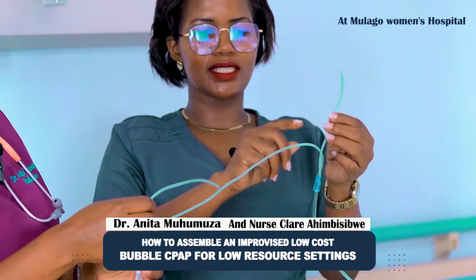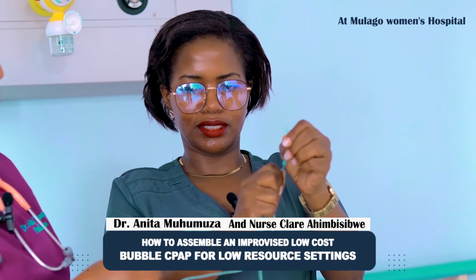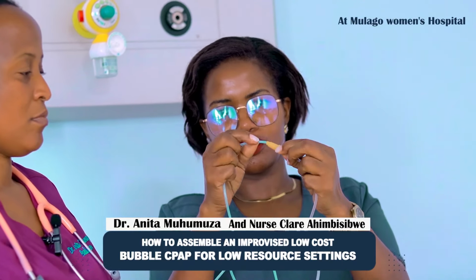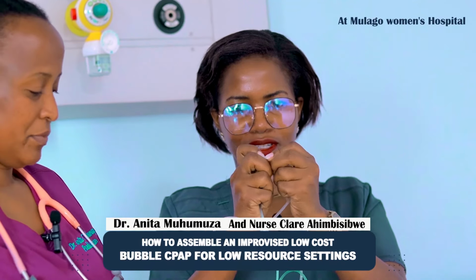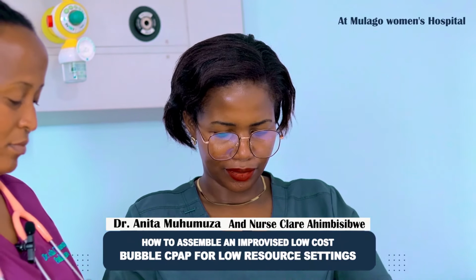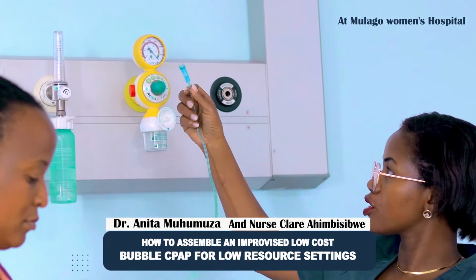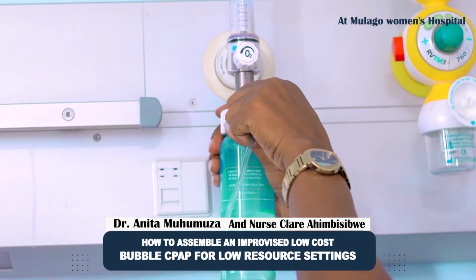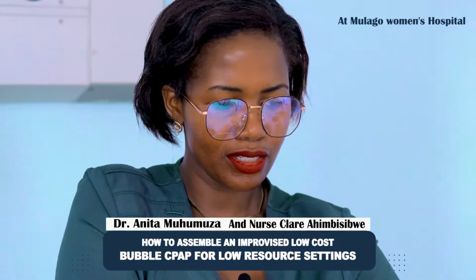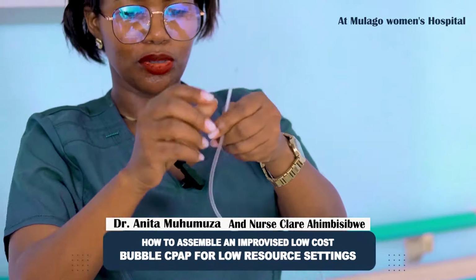We are going to tie this end so that we do not have any air leakage. And then we shall connect this end to here, to the orange one. You ensure it's tight. So we shall have this oxygen cannula coming from the oxygen source, then going to the baby, and then this end of the tube, we shall put it in the water.